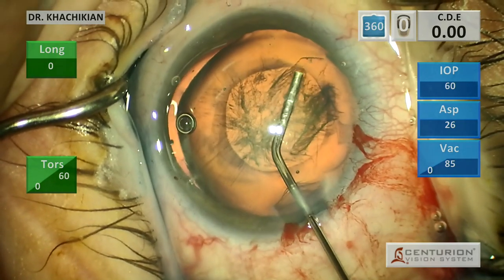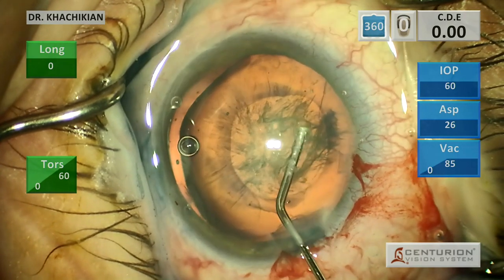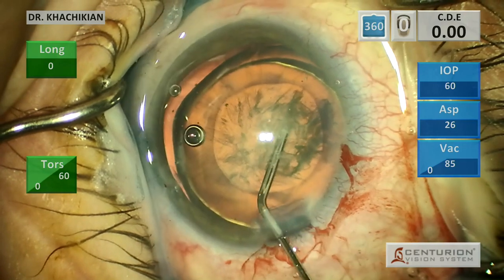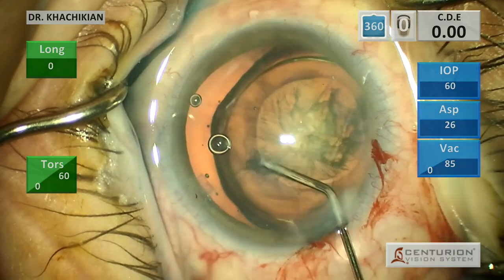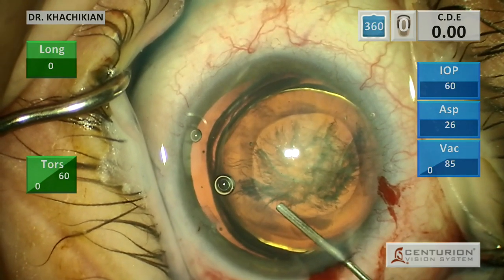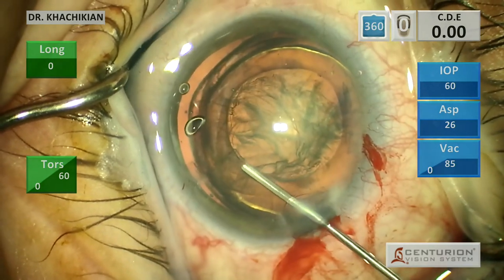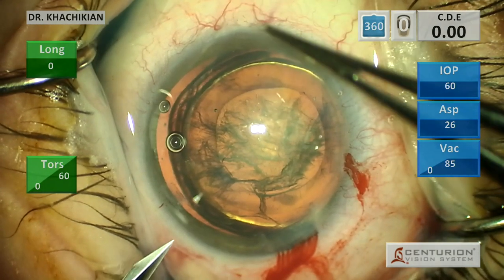We'll use a little bit of BSS and see what it's like - can we rotate this lens? We definitely want to get hydrodissection and hydro-delineation both. The reason for that is because one, we want to separate as much as possible the lens from the capsule so there's less cortex pulling on the capsule when we do our cortex removal. But two, if we get good hydro-delineation, then we can remove the nucleus of the lens without disturbing the capsule, because that hydro-delineation ring and that potential space will create a little buffer - a little shock absorber - so that when we remove the majority of the nucleus, we don't cause undue tension on the zonules.